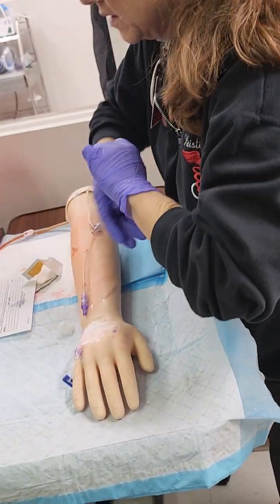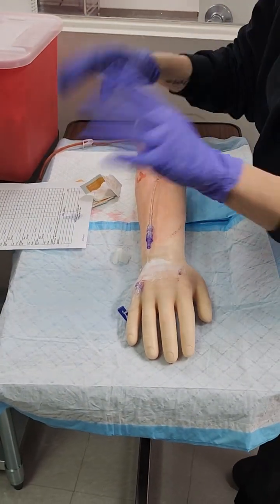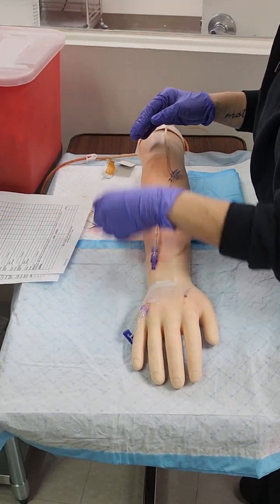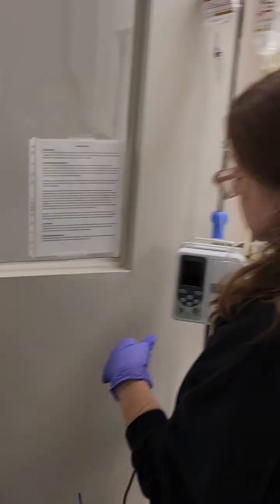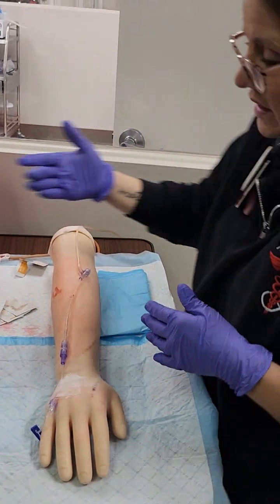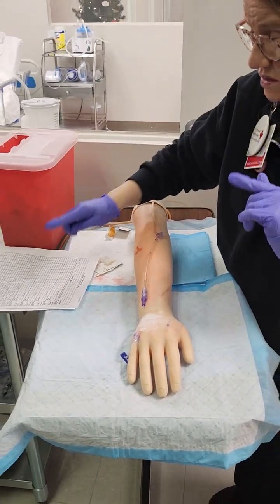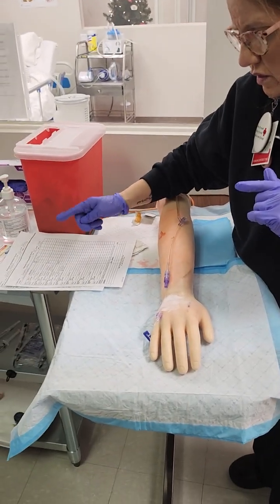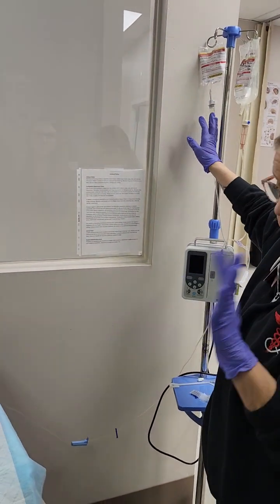All right, guys. I've taken off my gloves, washed my hands, and put on new gloves. When I look at my orders, it tells me that my patient has a continuous primary infusion. That's this one that's going, it's normal saline, infusing at 100 an hour. Then it tells me that I need to give Kefsol 1 gram, mixed in 100 milliliters of normal saline, over an hour. So I have a primary, and my Kefsol is going to be my secondary, my piggyback.